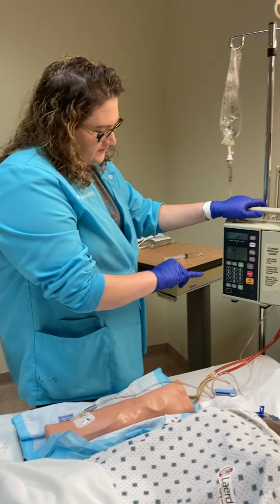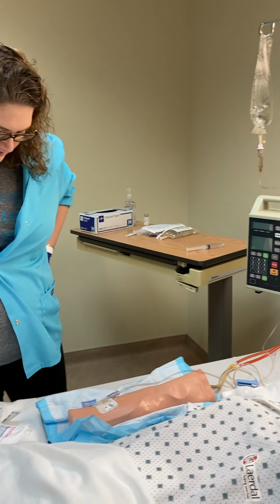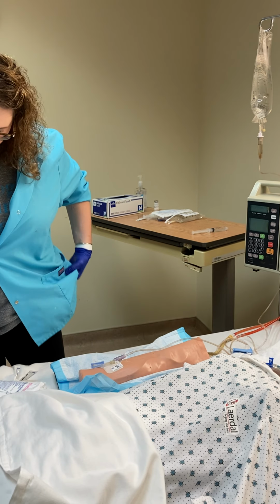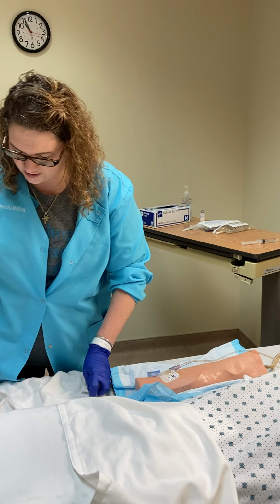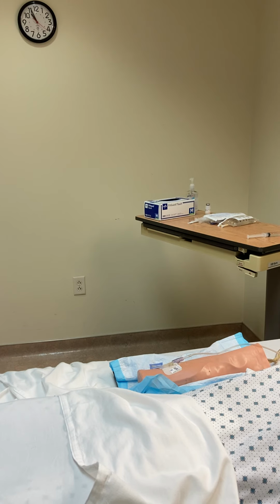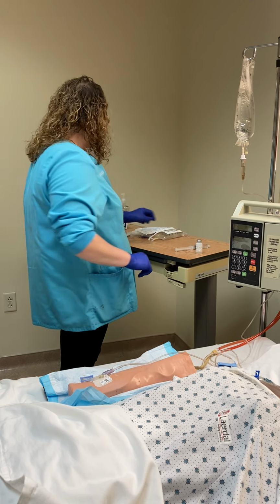To shut this off, we can hit stop, and that's going to pause, and then we hit on off to turn the pump off. Okay, so we got that. The next thing would be delivering an IV bolus, which is an IV push through an existing line. And we will always want to check compatibilities.